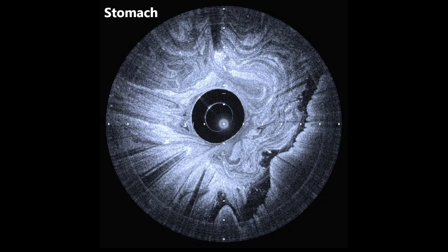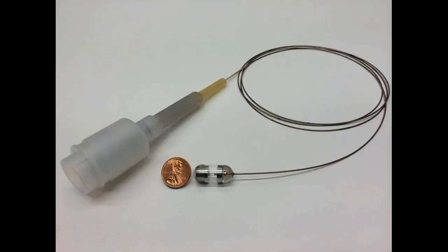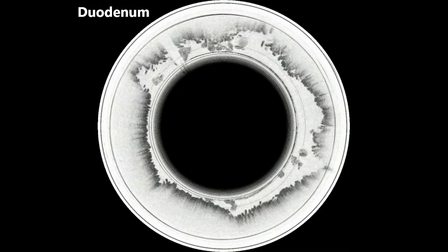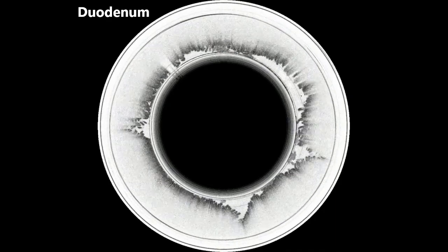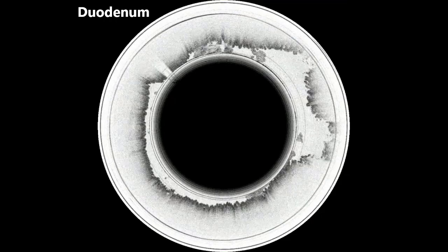We've also tried to go deeper into the GI tract. This is the stomach. This is a really pretty image, but it's actually digested food. You can see that swirly pattern is digested food. And then you can see the mucus layer and the layer of the stomach. We tried to get the capsule down into the small intestine, but we found out that we needed to put weights in it to allow gravity to move it through the pyloric sphincter from the stomach into the small intestine. And when we do that, we get these really pretty images of the duodenum, and you can see the duodenal villi. These are the absorptive architecture that exists in the small intestine. You can see it in real time and live.